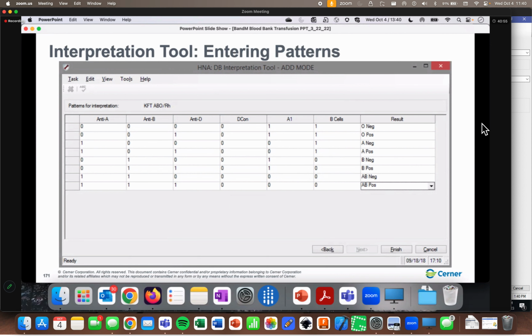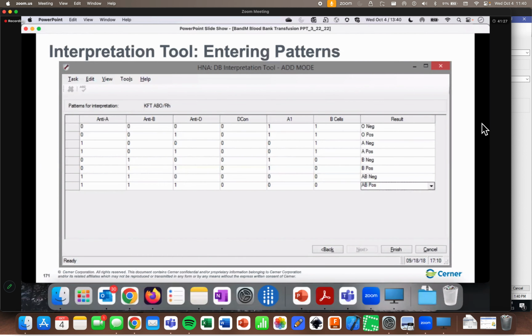Now, one thing that folks ask me pretty often is, why are the hashes defined as numbers? Right? You'll see that there's zeros, ones, twos, threes. That is another sign of just how old this tool is. So, as I'm sure you guys probably know, computers actually prefer processing numbers rather than characters that are not numbers.